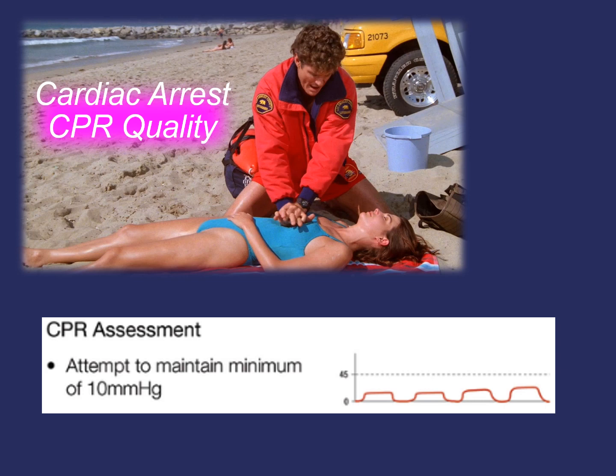While assessing the quality of CPR, it's also important to ensure the efficacy of positive pressure ventilations. When utilizing end-tidal CO2, we can easily keep track of our ventilation rate, as respiration rate is displayed on our Zoll monitors.